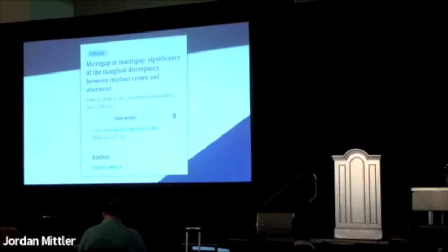But it was about not the micro gap, it was about the macro gap. My feeling was that putting large gaps, crown margins fitting on abutments subgingivally, created more of an insult to the health of the tissue than actually the micro gap did. That was my take. And I thought the industry didn't really respect that transmucosal area the way they should. And I thought it was the bigger problem.